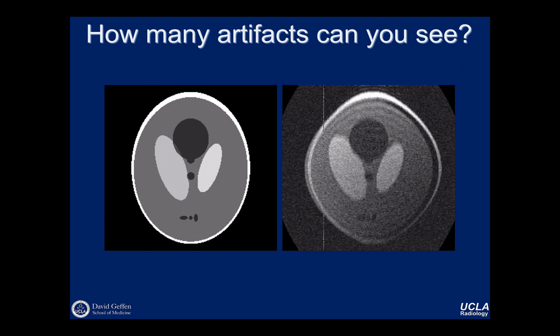Well, in the one we saw where it made the image, there were coils all the way around, kind of, like you could assume. Yeah. But obviously they favor what they're closest to. Yep. So what do you think is happening? Obviously, things are sort of darker down here. So what do you think is going on down there, for example?